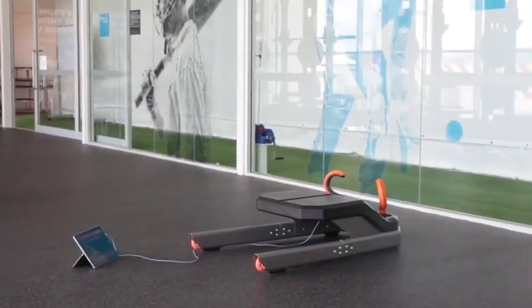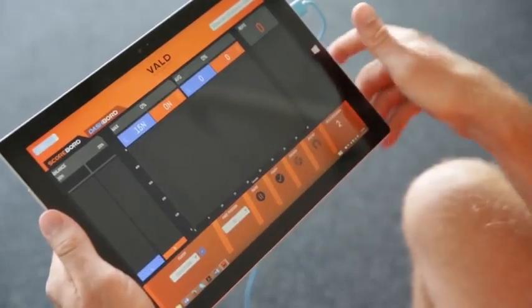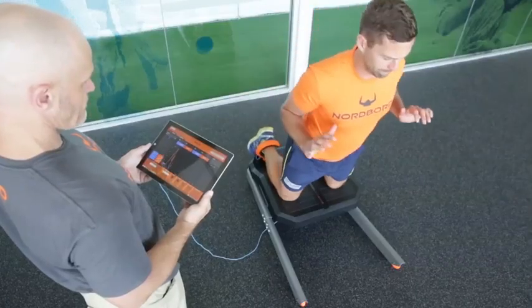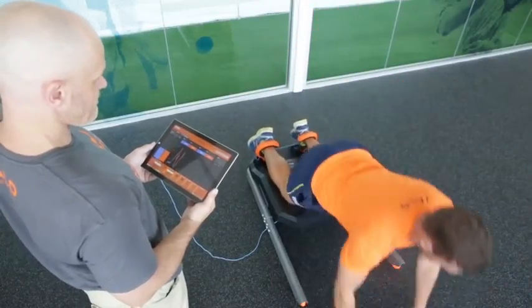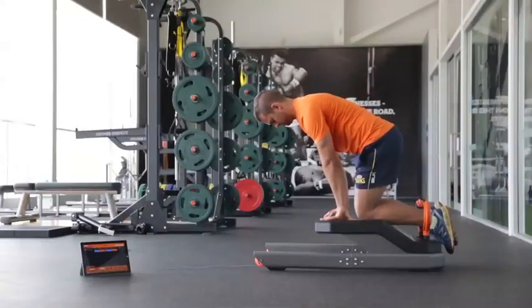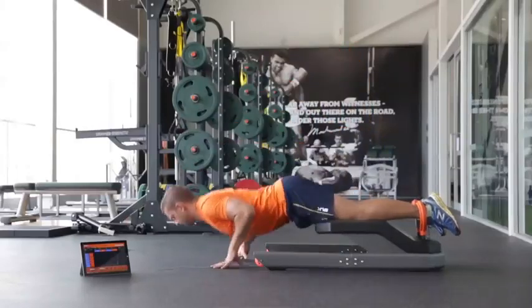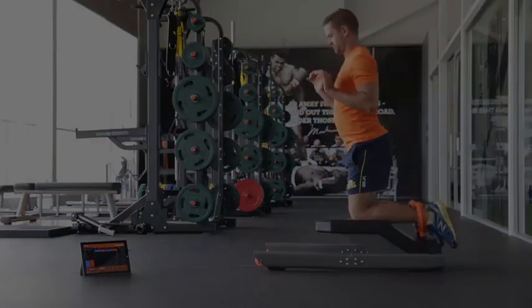The Nordboard Hamstring Testing System by VALD Performance is the fastest, easiest and most accurate way to field test your athlete's hamstring strength. All the athlete has to do is get on board, hook their ankles in, lean forward and resist falling as long as they can, then catch themselves when they can't hold any longer.